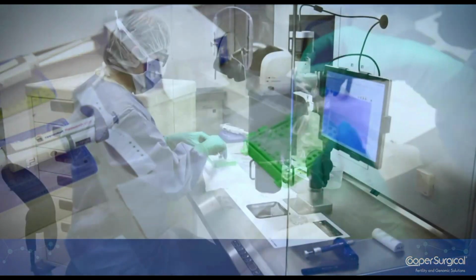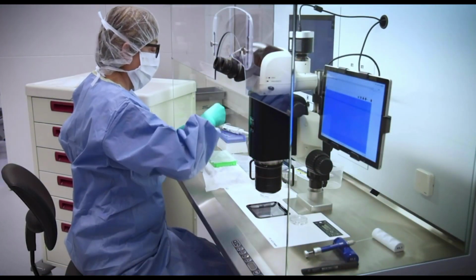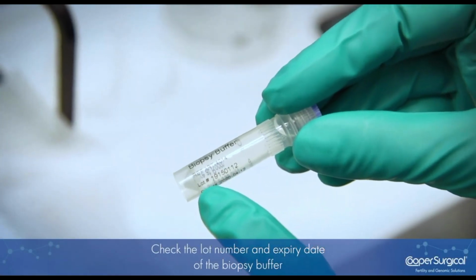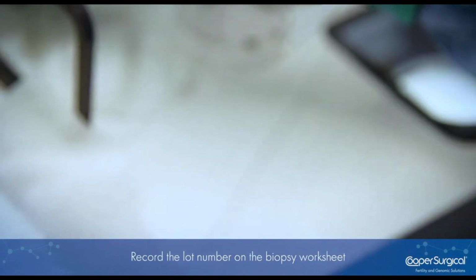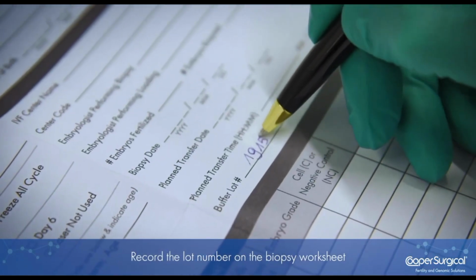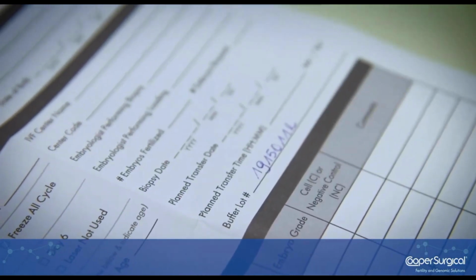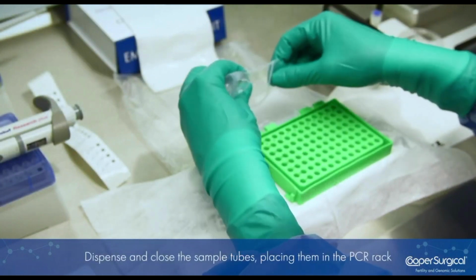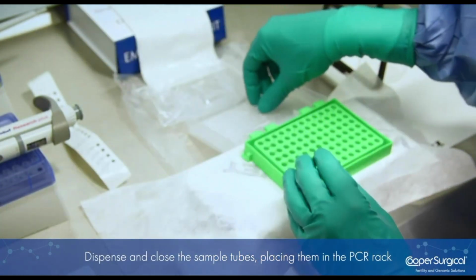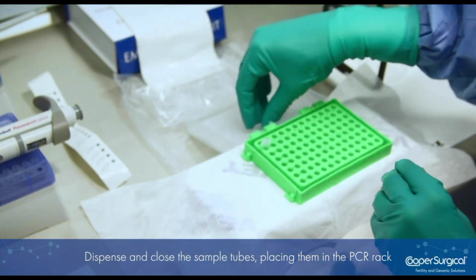And here we find our buffer. We will take out the buffer that we will use for the washing and the tubing. We will check the lot number and the expiry date and record all that on the biopsy worksheet. Here, of course, it's the witness who is recording this on the biopsy worksheet. Then we will take out a maximum of 5 tubes. We will close the tube bag, and then we will close those tubes immediately and put them in the rack.